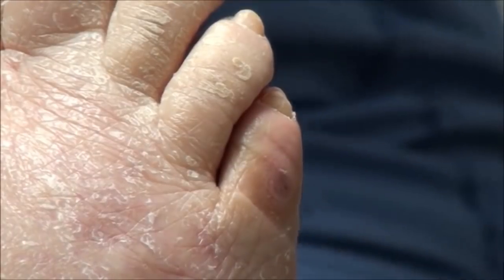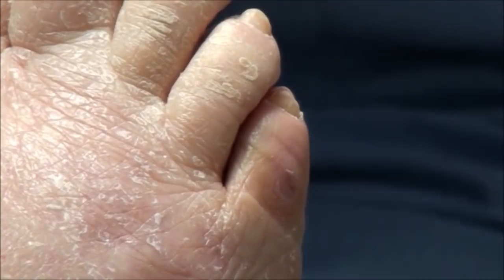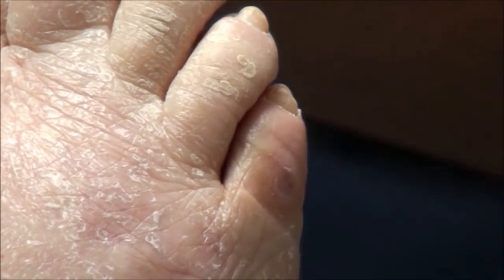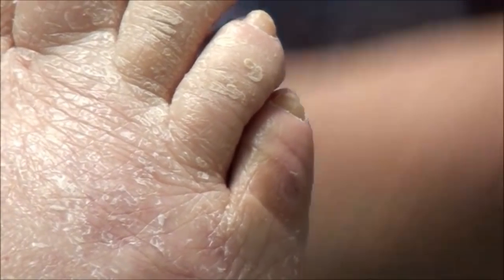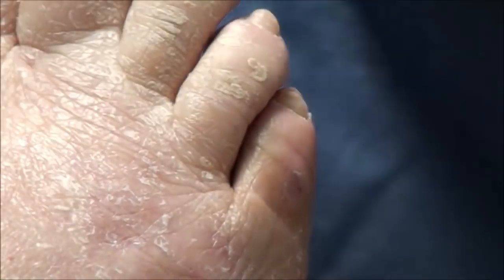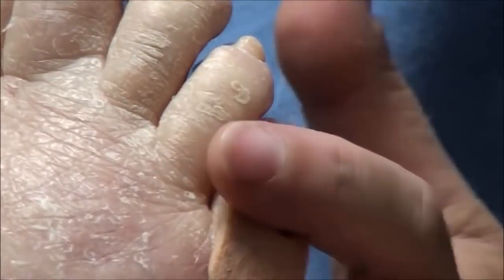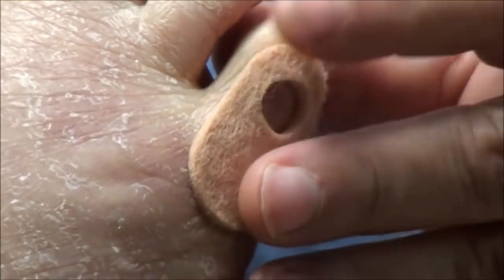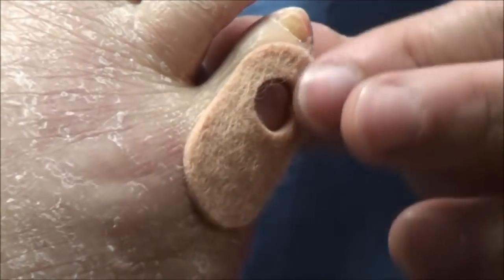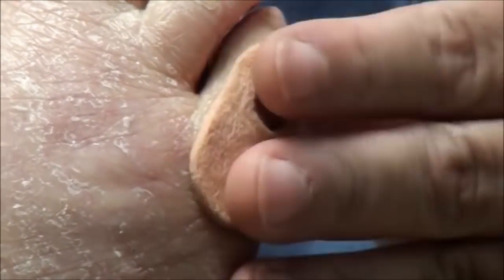Do you ever put a little corn pad or something on it? The patient recalls using one a couple of times when it was very bad. I'm going to give you a handful of these pads — they have a little pre-cut hole in them. What you do is put the sore spot right in that hole. That allows the shoe pressure to be taken up around that pressure point instead of right on it. These are real thin ones so they won't take up too much room in your shoe. When I see you back in a couple of months for your regular routine care, we can talk about whether this worked.